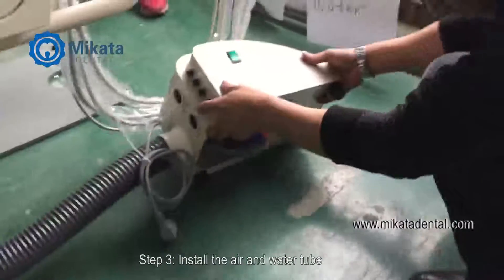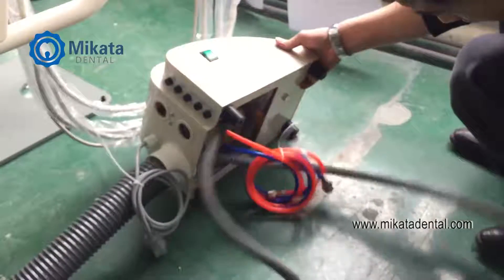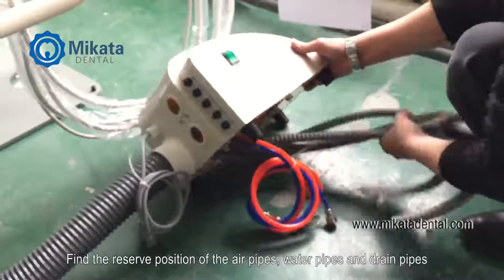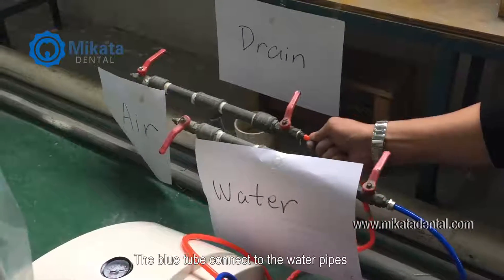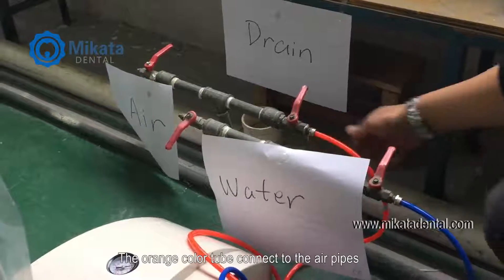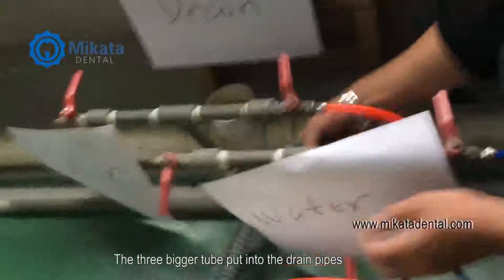Step 3. Install the air and water tube. Find the reserved position of the air pipes, water pipes, and drain pipes. The blue tube connects to the water pipes. The orange tube connects to the air pipes. The three bigger tubes go into the drain pipes.